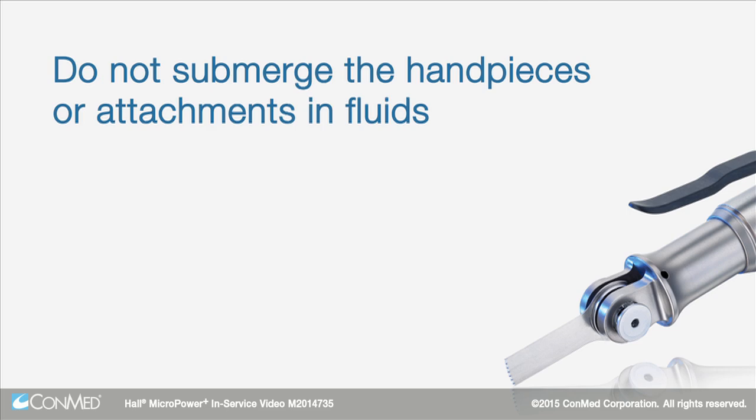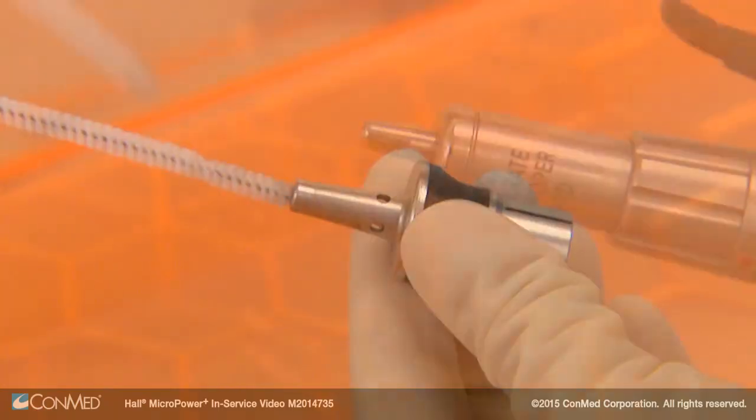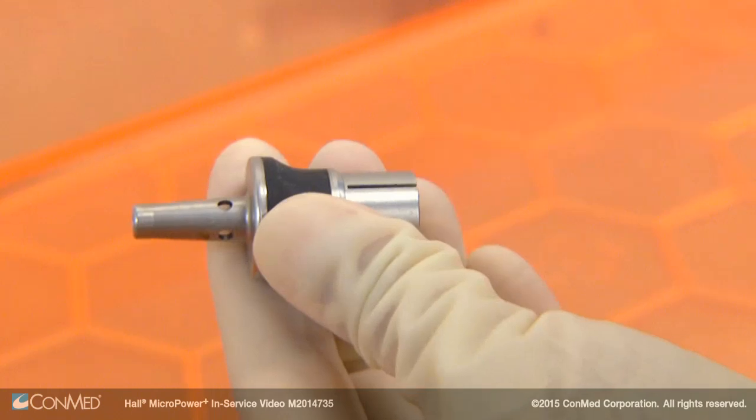Do not submerge the handpieces or attachments in fluids. Remove debris from the cannulation of the handpiece or attachments by feeding in the wire end of a clean brush. Pull the brush completely through.